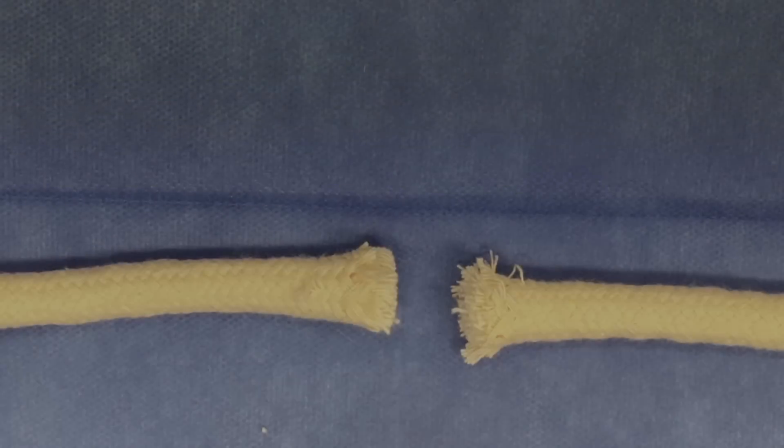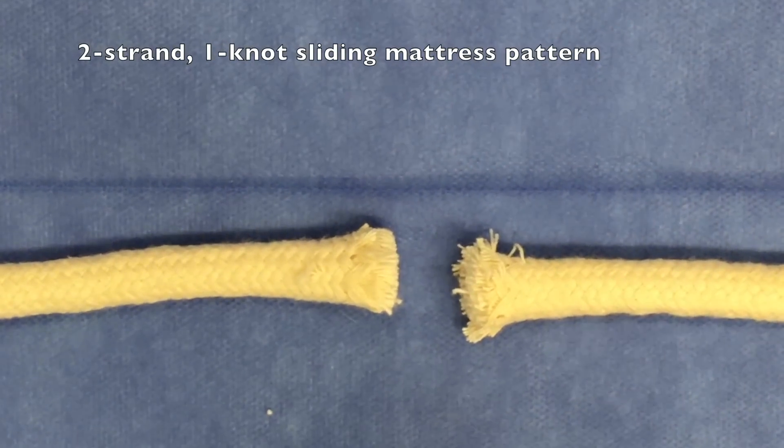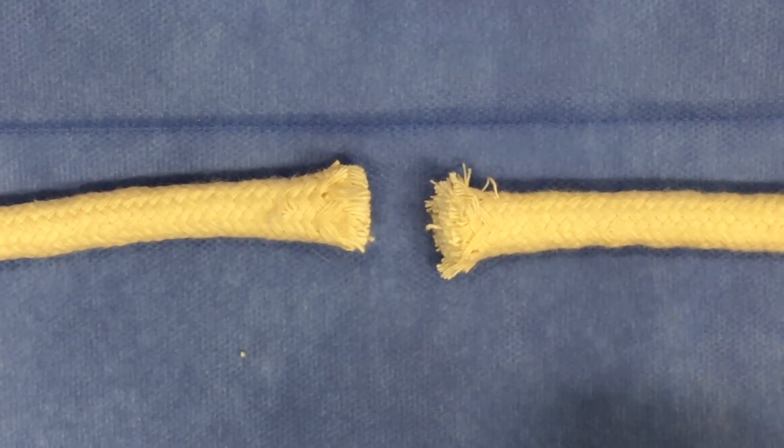We'll start with the two-strand, one-knot sliding mattress suture pattern. I like this one because it uses a kind of familiar pattern to the average emergency physician, which is the horizontal mattress suture pattern. So here's how it goes.